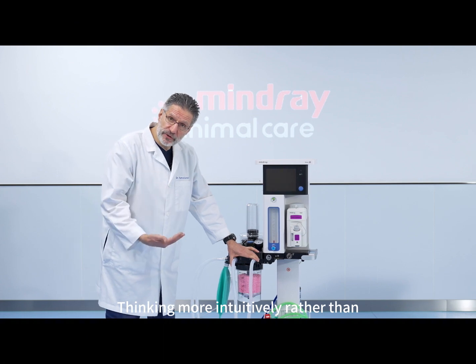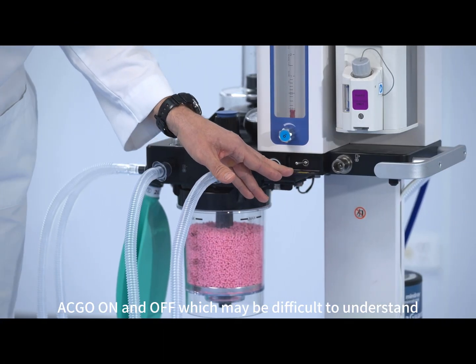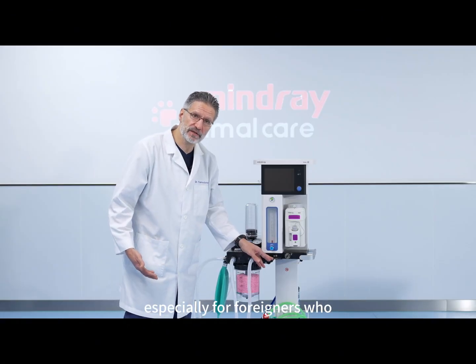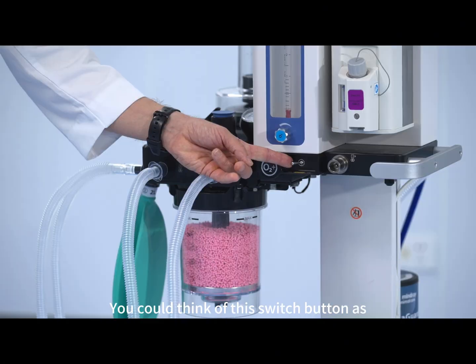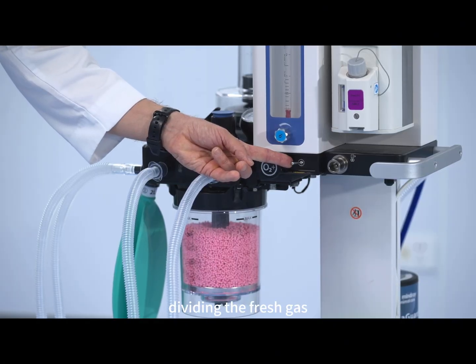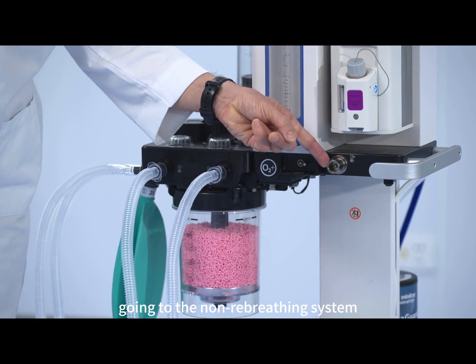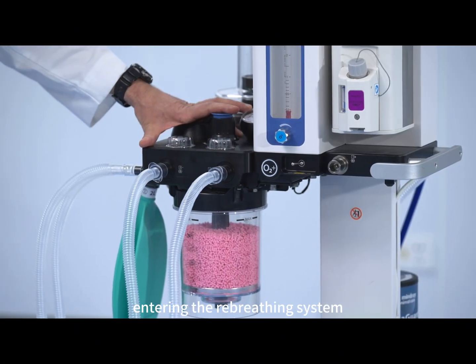Thinking more intuitively, rather than ACGO on and off — which may be difficult to understand, especially for foreigners who are not native English speakers — you could think of this switch button as dividing the fresh gas either to the right, going to the non-rebreathing system, or to the left, entering the rebreathing system.